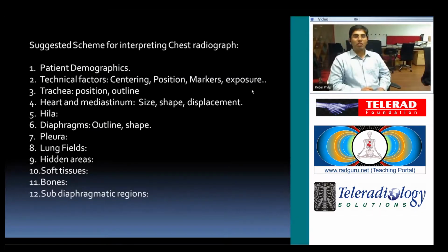First, at the topmost is the patient demographics. You have to ensure that you are reading the right person's radiograph. You have to check the side markers, the right and left side markers, and the date. Make sure you are reading the current examination. And then, if the priors are available, always compare. It's really of great use, comparing with the old radiograph. It will solve a lot of problems. So that's about the patient demographics.